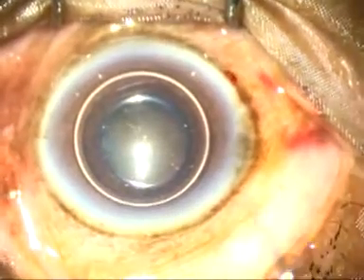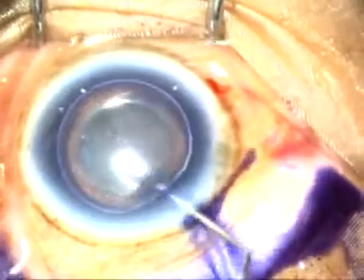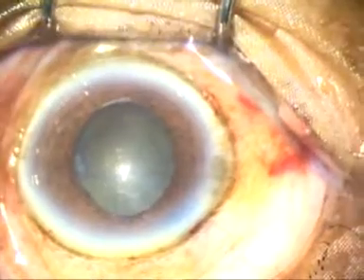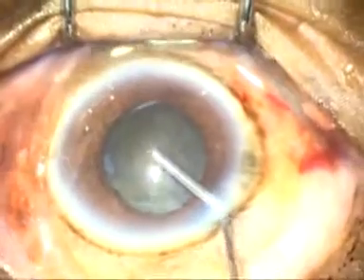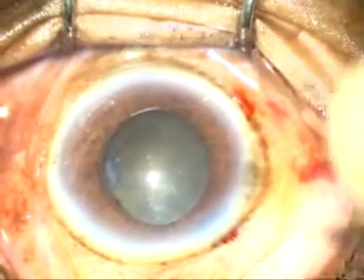An air bubble is injected, and underneath this air bubble, trypan blue dye is placed. A little bit of adrenaline is injected to see if the pupil dilates, but in this case the pupil didn't budge. The size of the pupil was such that I was hoping to manage this case without using any pupil expansion device.